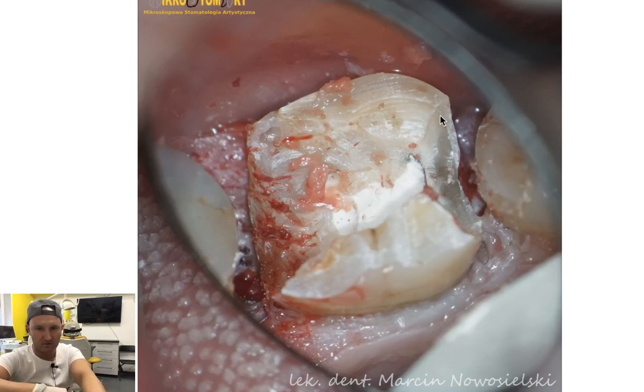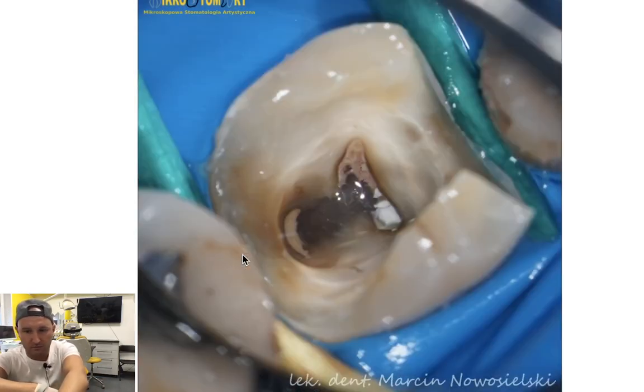The caries is subgingival, so it won't be easy. I assume we all know that in this case you need to perform a gingivectomy to expose the margin of your preparation, and you need to do it in the rubber dam.